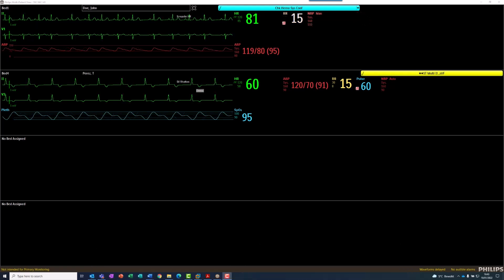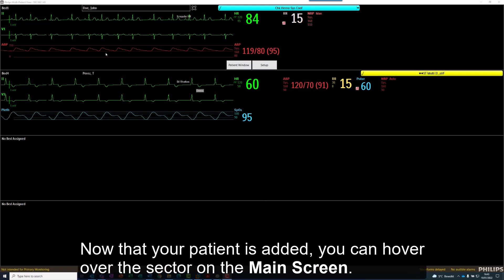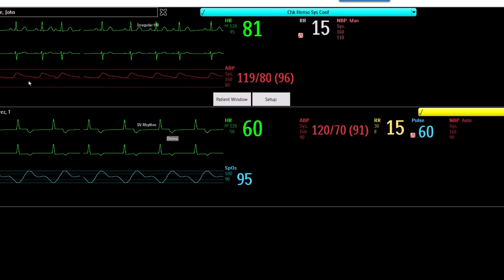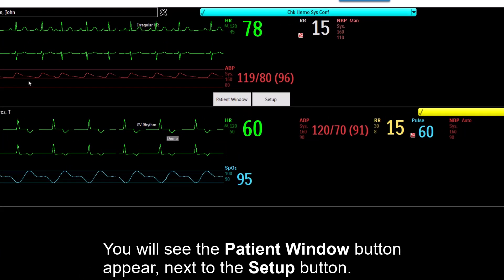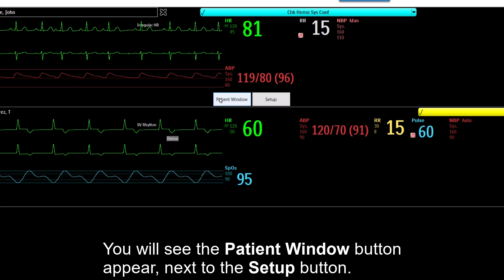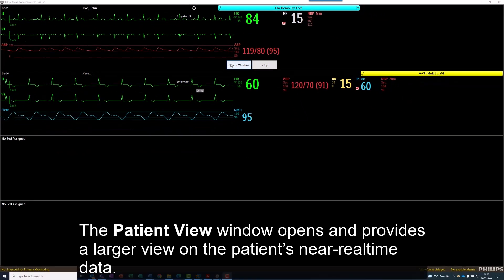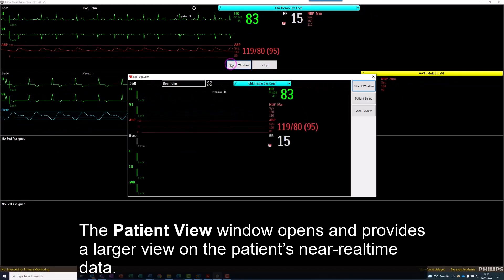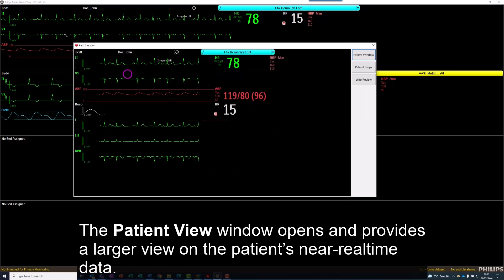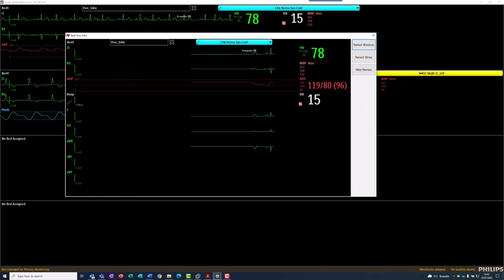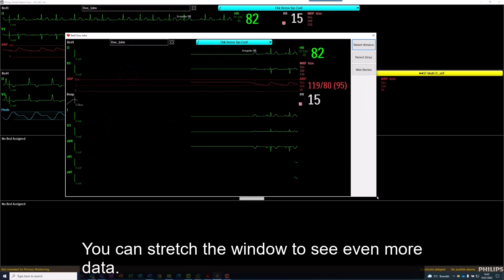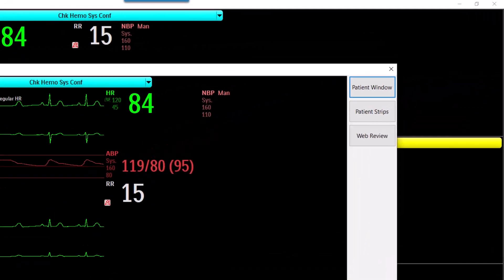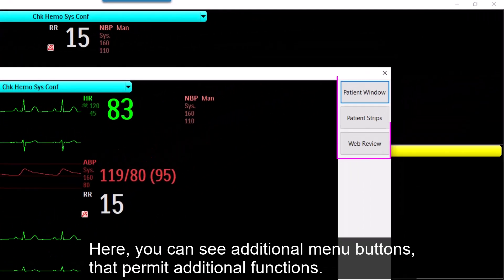Now that your patient is added, you can hover over the sector on the main screen. You will see the Patient View button appear next to the Setup button. The Patient View window opens and provides a larger view on the patient's near real-time data. You can stretch the window to see even more data. Here, you can see additional menu buttons that permit additional functions.